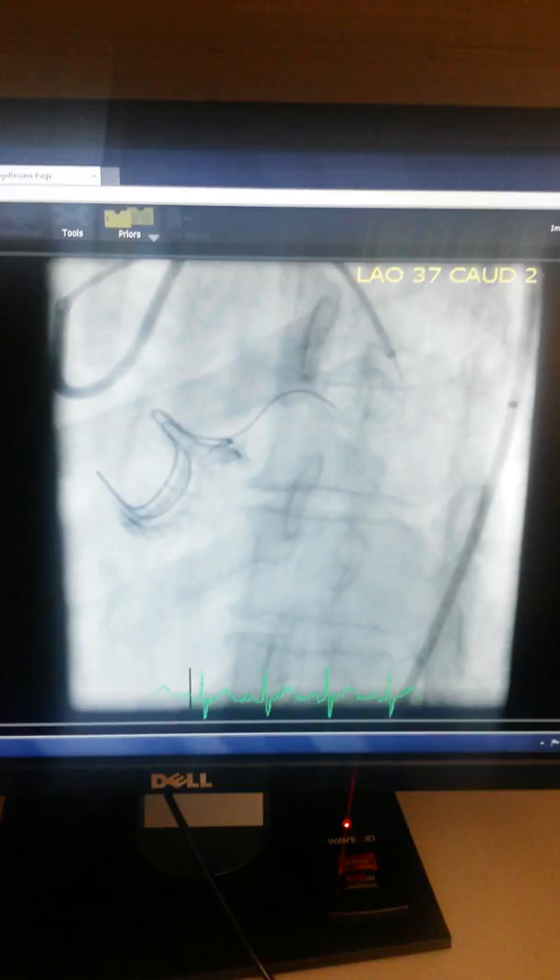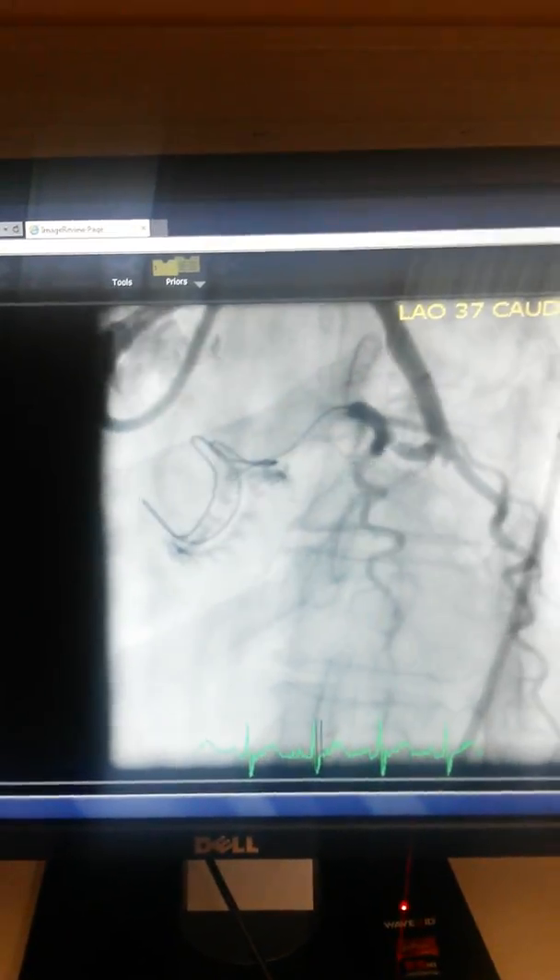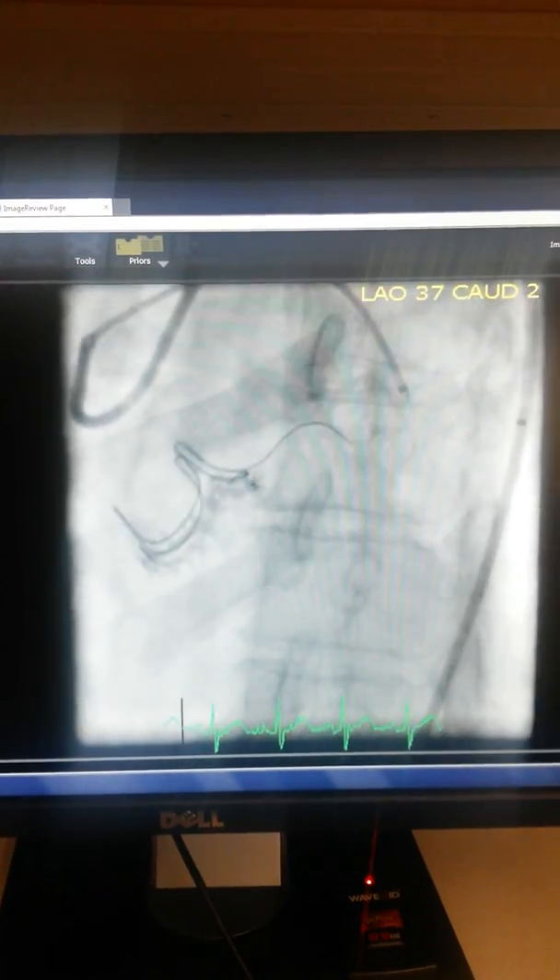Now it looks like the tail of that water is slipping a little bit with the valve opening. Is that true or false? It's hard to say, but it could be just the flow that's pulling that up.